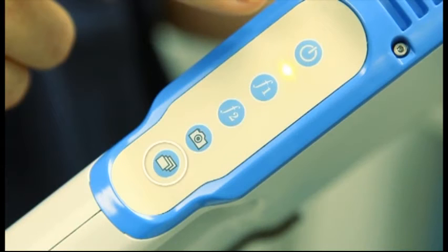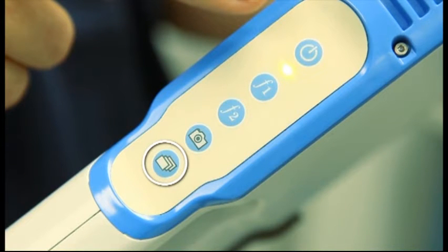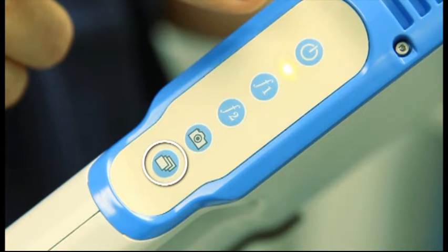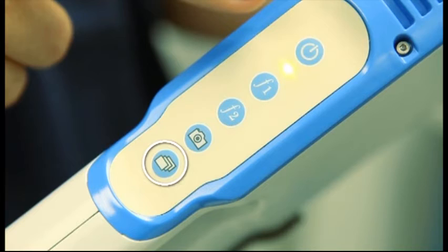Once these modes have been purchased and unlocked, activate fine detail and then inverse by pressing the mode button sequentially. VainViewer Flex cycles through the various imaging combinations.